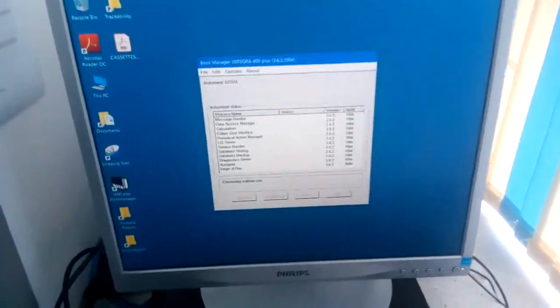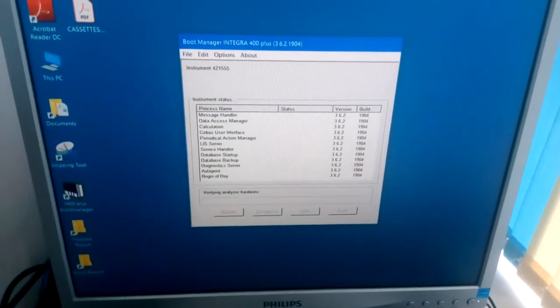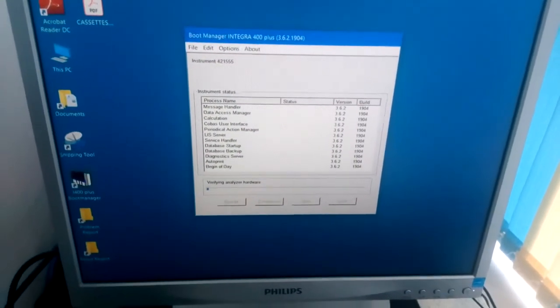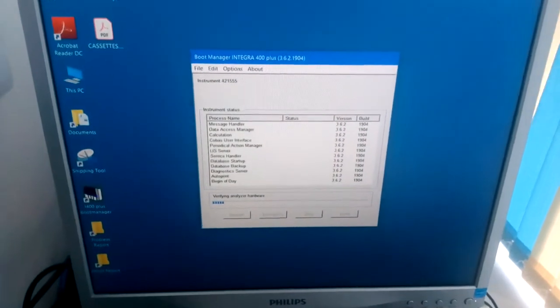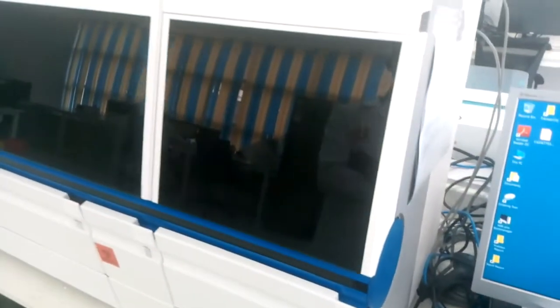So this is how the machine starts. It's performing verification, analyzing hardware to confirm everything — all the robotics are okay inside the machine.